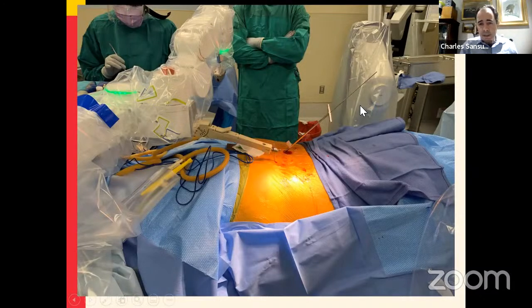This is the setup after the ileosacral screws had been removed. The robot was utilized to drill a guide wire trajectory into the SI joints. The guide wire was placed into the SI joint along the trajectory drilled by the robot.